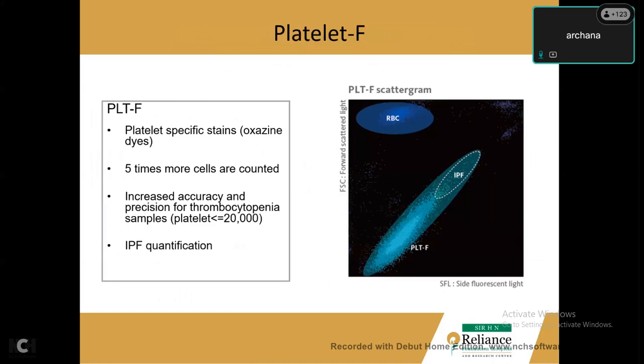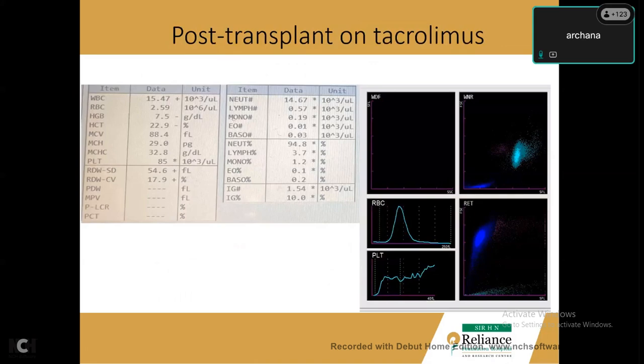Showing you the same. The immature platelet fraction is actually derived from this fluorescent platelet count, and just to show you one case where we got 85,000 as the platelet count, but look at the histogram. One can definitely not rely upon this. And if you see the reticulocyte histogram, it's showing you this population here of large platelets, and it's also showing you some reticulocytes, but it's showing this big trail down to possibly microcytes or something else that's interfering.